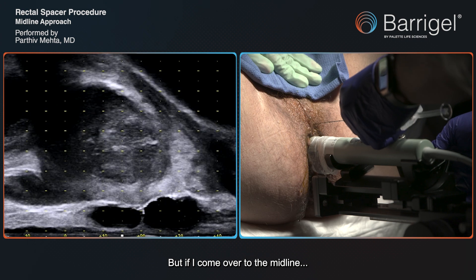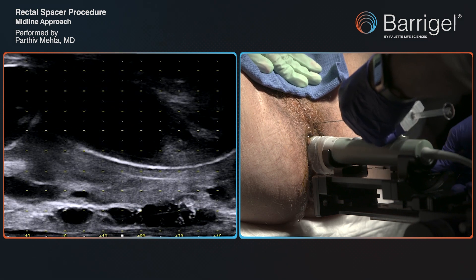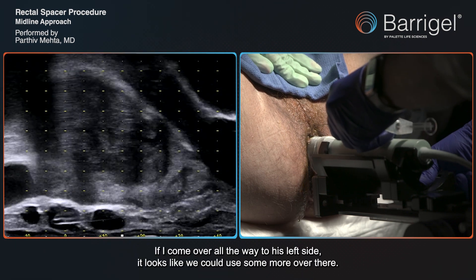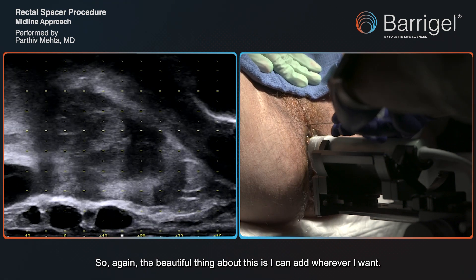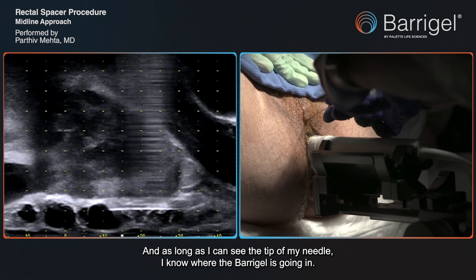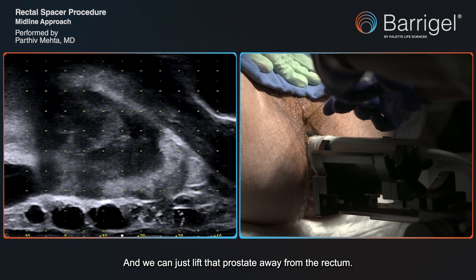If I come over to the midline it looks good there. If I come over all the way to his left side, it looks like we could use some more over there. The beautiful thing about this is I can add wherever I want. As long as I can see the tip of my needle, I know where the BaríGel is going in, and we can just lift that prostate away from the rectum.